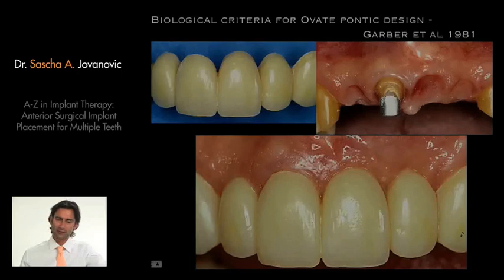And to counter the problem of 2 implants next to each other and the problem with the gingival papilla, what we do today for implants is that we use some of the good advantages and results of traditional prosthodontics.